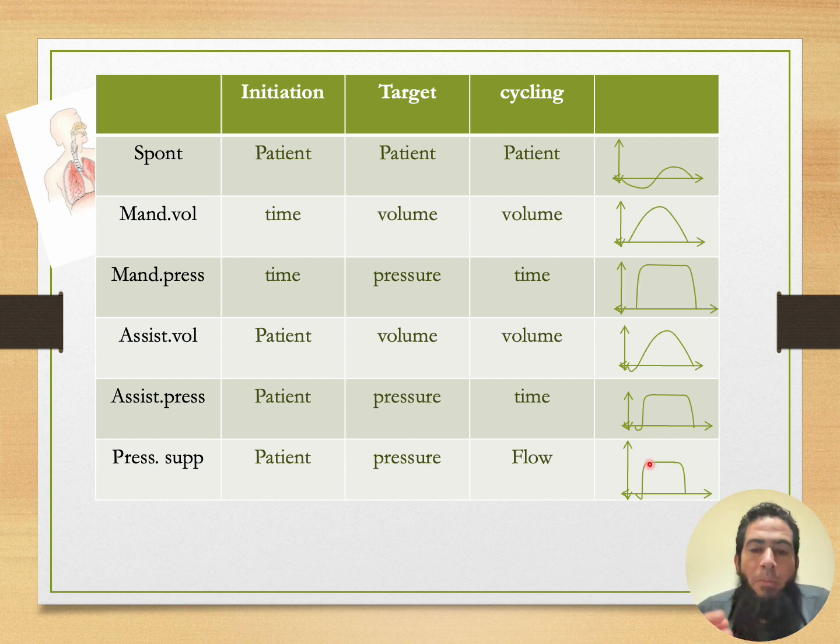By the time the patient doesn't require any more air, he starts to slow down the airflow going in. Even if the pressure stays the same, the patient, by just fixing the volume of his chest, not relaxing anymore to take any more air, the flow will come down.